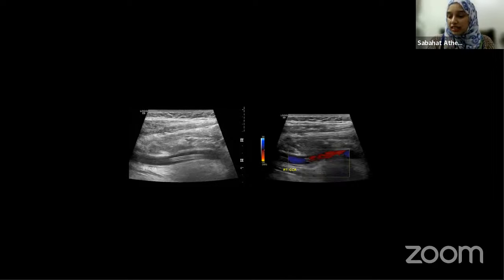When we did the ultrasound, of course, it was recently done. It was all heavily packed up. We could only scan part of the neck. And on the neck, the catheter was in the vein. And the ICU physician said, I know this is arterial. So what did I say to him? I said, look, I'm not disputing what you're saying, but I'm telling you what I can see on the ultrasound, and on the ultrasound, it's in the vein.